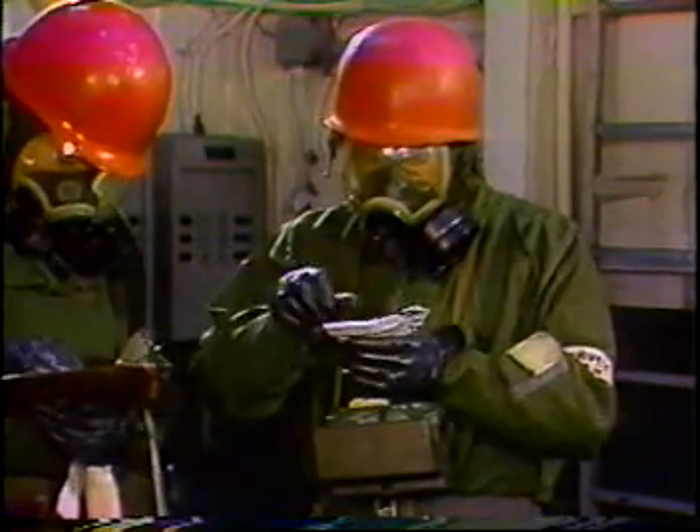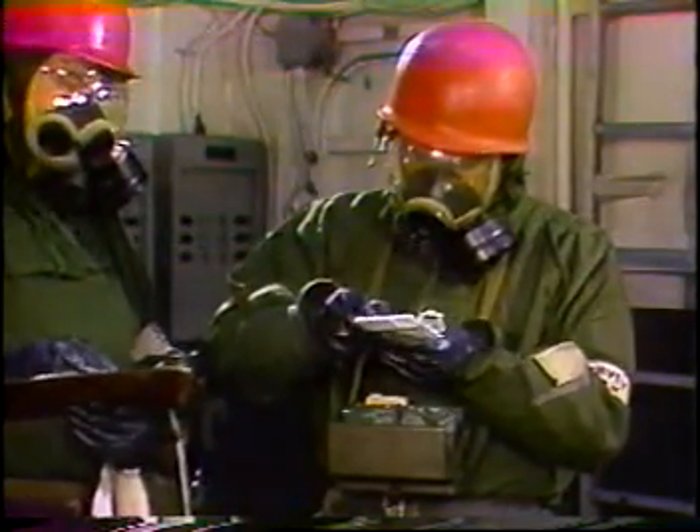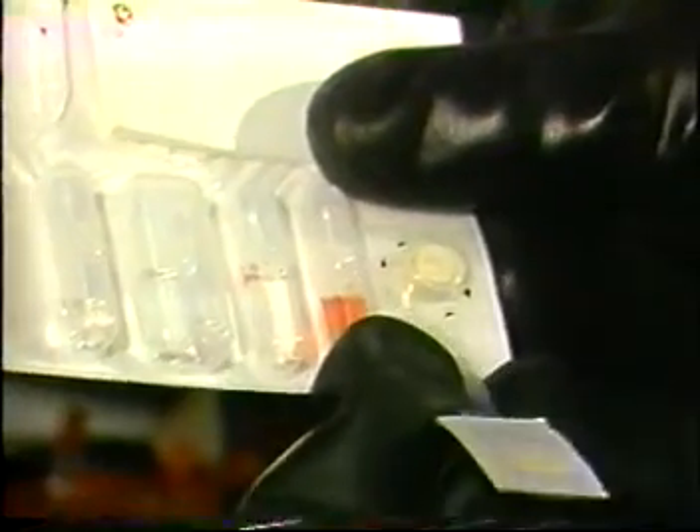Step by step: Remove the tab labeled number one. This reveals the lewisite detecting tablet. With the top half of the white paper on the rub strip labeled number two, rub the lewisite detecting tablet. Keep rubbing until a mark is visible on the rub strip's white paper.